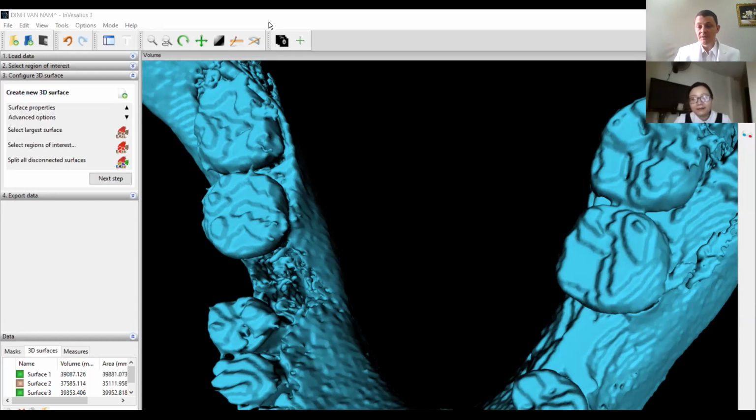And in fact, if you look at the case of Christian, of course it will be difficult to convince the patient now. Yes.